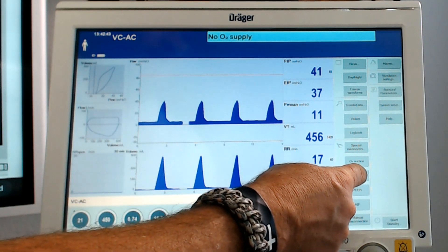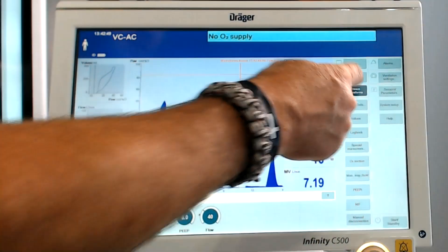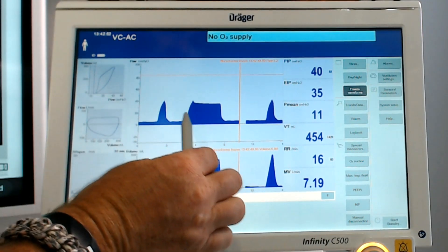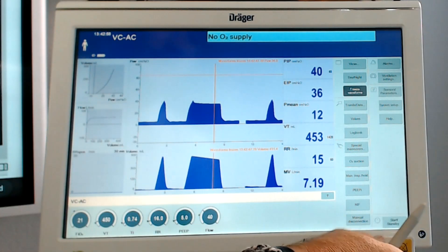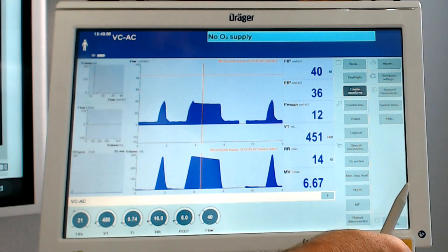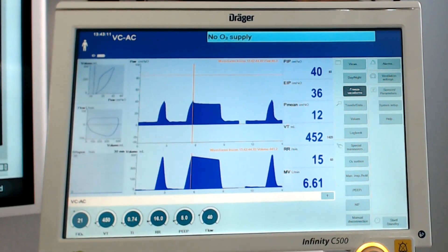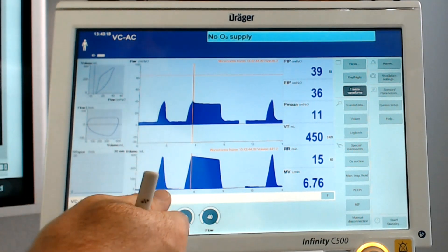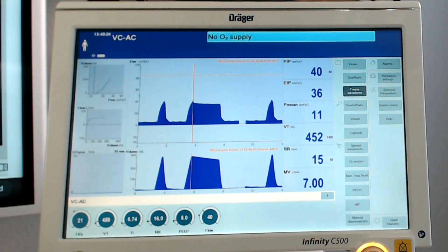We're going to do the same inspiratory hold and look at our plateau pressure. Freezing the waveform — it looks identical to the first one except higher. Our plateau pressure is reading 34.8 to 35.2, so we'll call it 35 cmH₂O. Peak inspiratory pressure we'll call 40 cmH₂O. When we look at volume delivered, we're at 449.8 — we'll call that 450 milliliters.